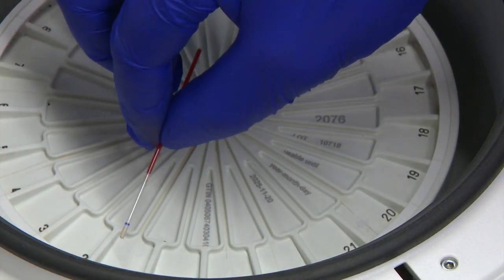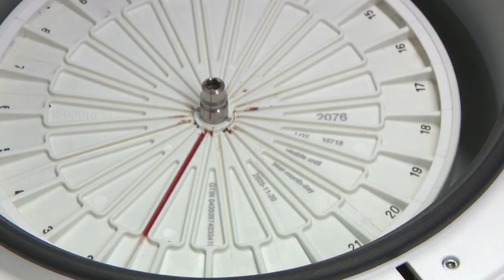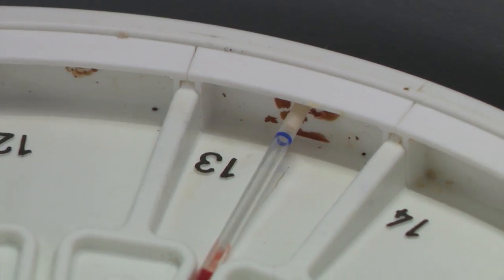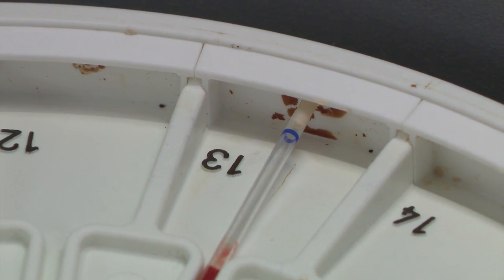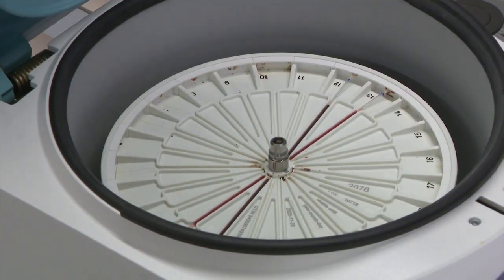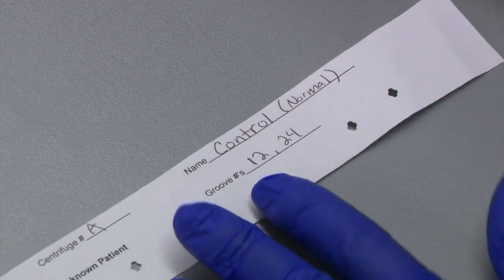Place the patient and control micro hematocrit tubes in the centrifuge with the clay plug facing out by first tucking the clay end under the rubber lip of the outer edge. Make sure the clay end is against the rubber wall in the groove. Make sure you balance each micro hematocrit tube. Record the centrifuge number and groove numbers used for each micro hematocrit tube on the sheet.